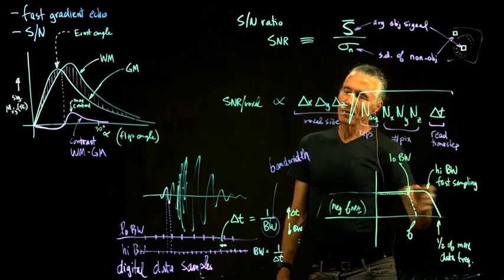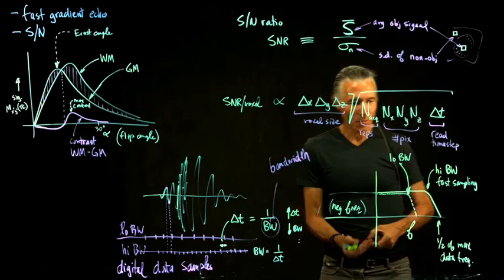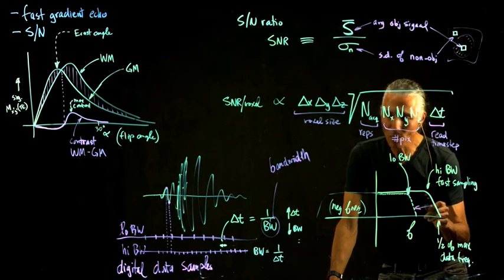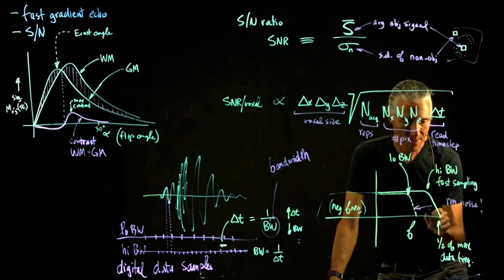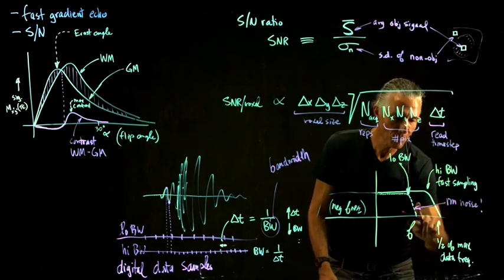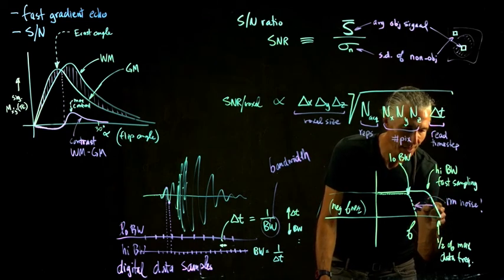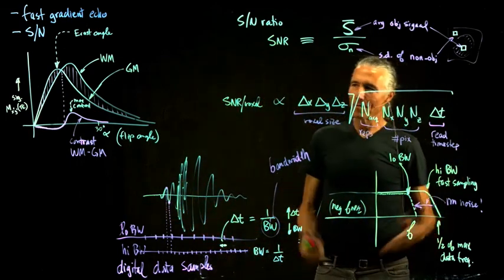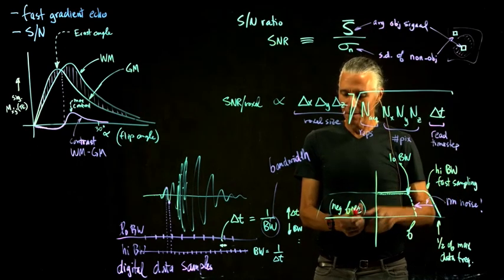We're filtering out any junk that's higher frequency, and so we can sample at a lower rate. When you do that, you will remove noise. When you move to a lower bandwidth, you filter out more noise, because there's noise in the environment of all kinds. If we filter more of it out, we're going to have more signal.